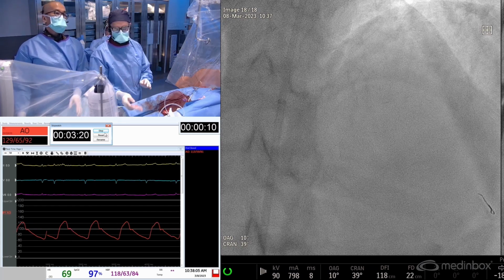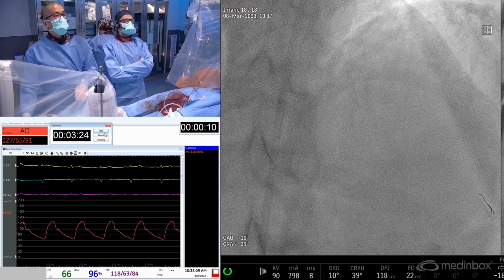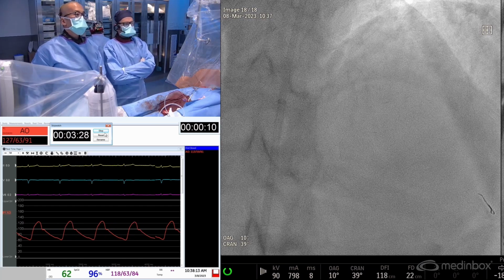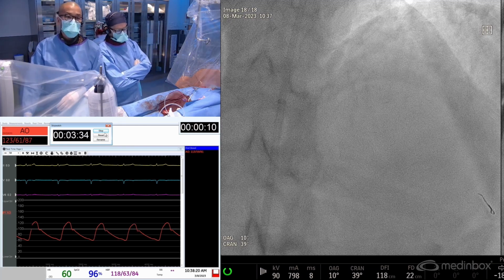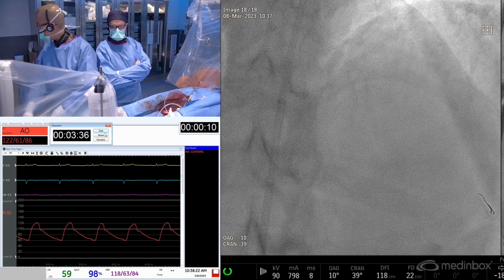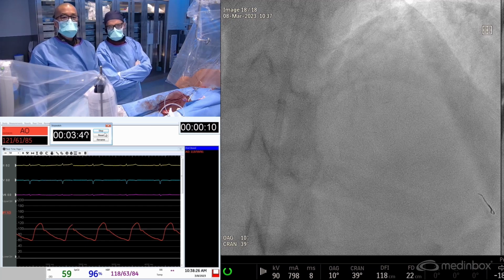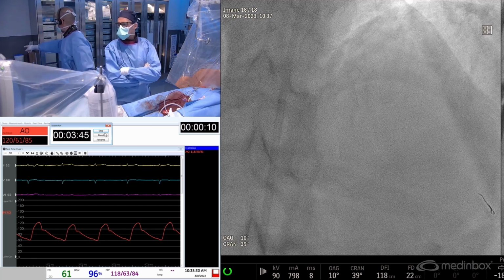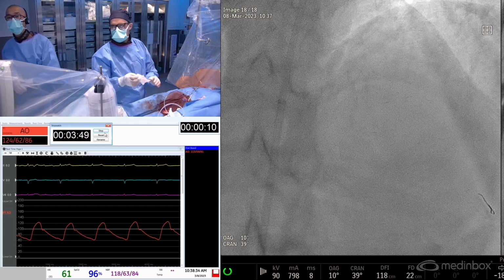And right now we're estimating visually, of course, we'll at least confirm by OCT that we have at least a 3.5 to close to 4.0 caliber in the prox LAD, hence our move all the way up to the 1.75 burr. Yep. We're just waiting for the burr to be opened, the next burr. But also decrease the fluoroscopy intensity if possible.